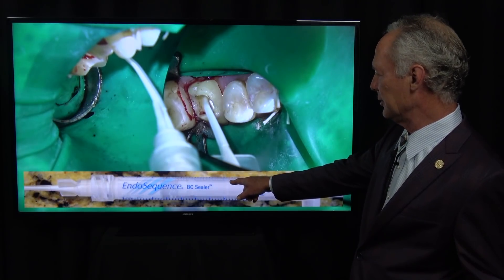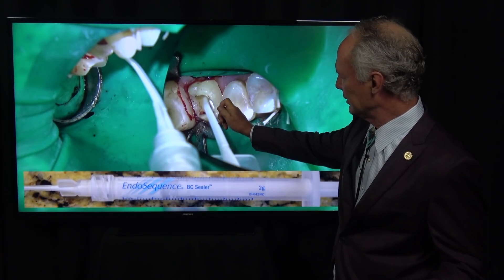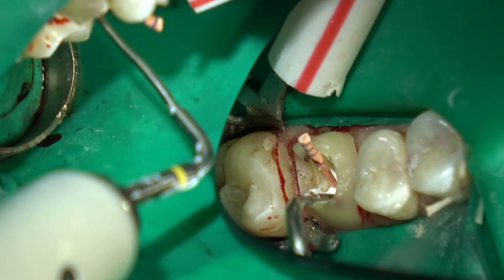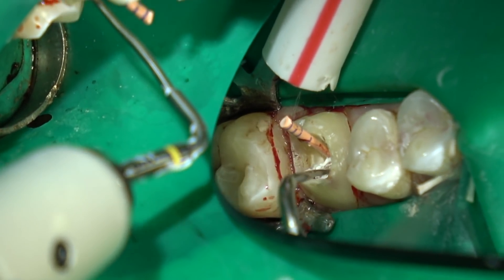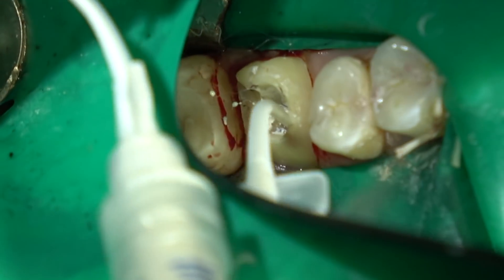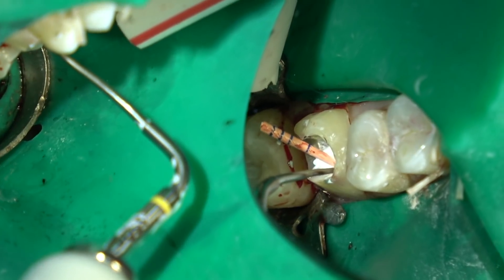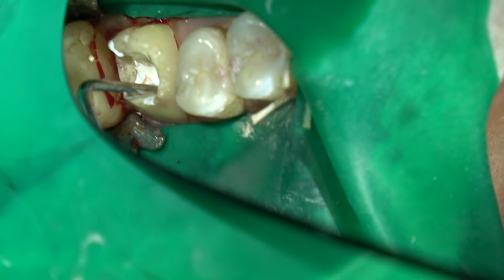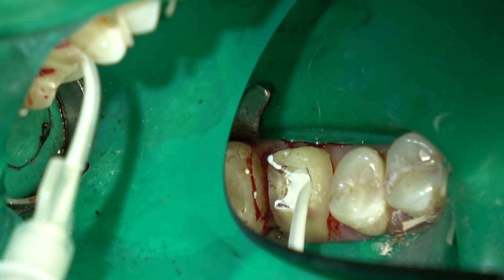Here's the EndoSequence BC sealer — inject it under a little bit of pressure into the canal, then place the gutta-percha cone. Don't move it up and down or you'll incorporate air bubbles. Then use the heating element to sear it off in the canal. Second canal: squirt the BC sealer in under a little bit of pressure, use the heater to sear it off, then come back with a small plugger and plug it into the canal.